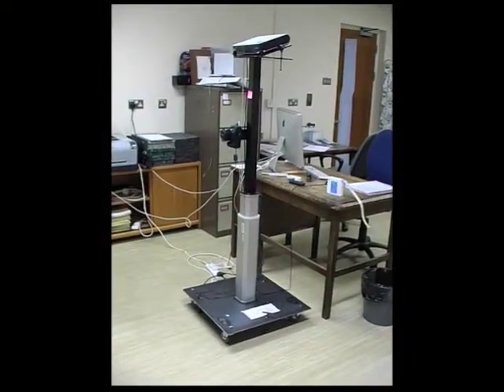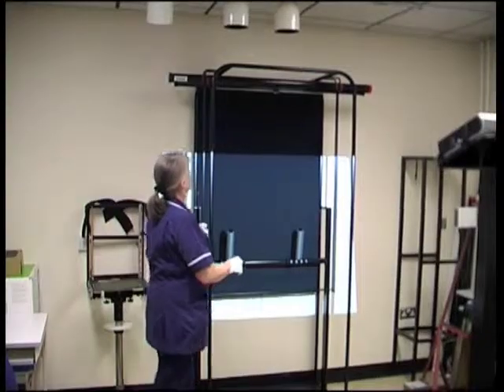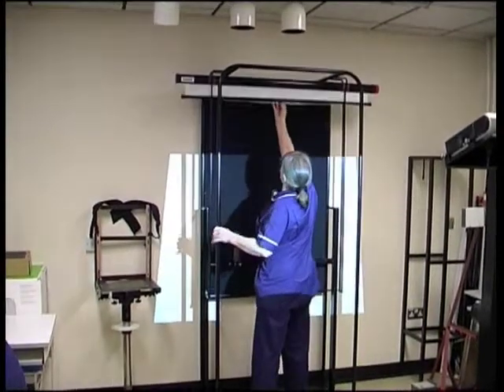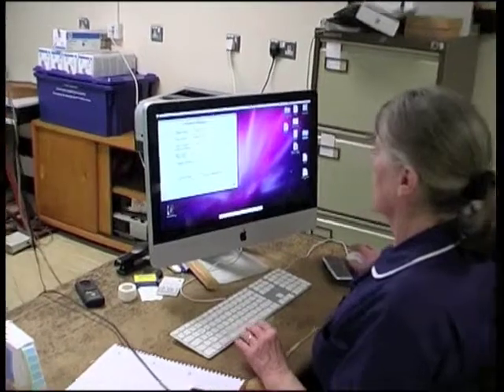The system consists of a camera and projector stand, a patient stand including a built-in reference plane, and an iMac.